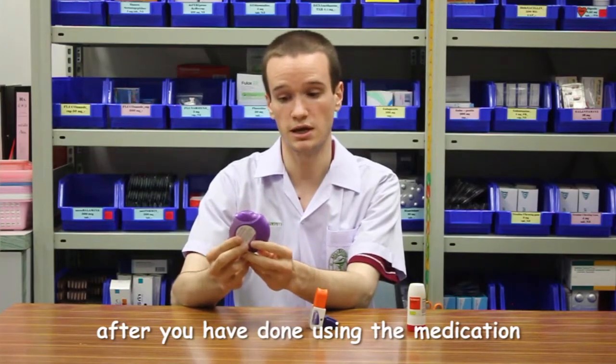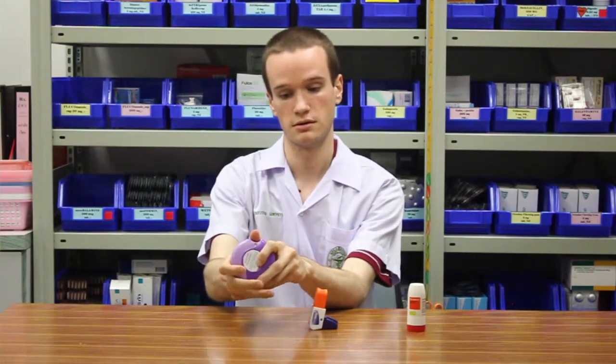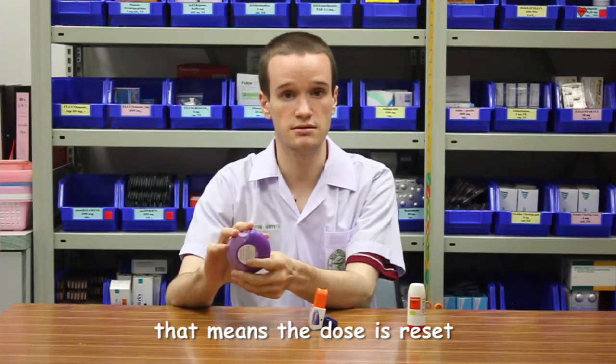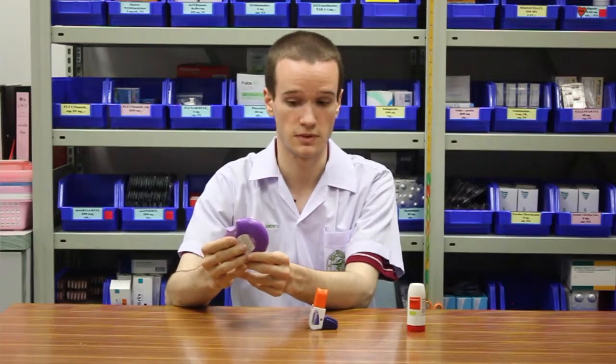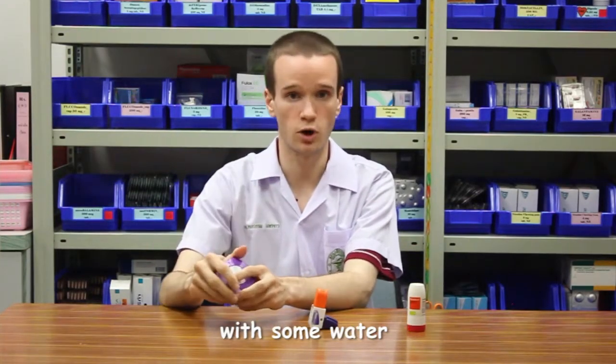After you're done using the medication, you flip the medication closed like this, and after you hear the click, that means that the dose is reset and it's ready for the next dose. And then after you're done, you want to make sure that you rinse your mouth out with some water.